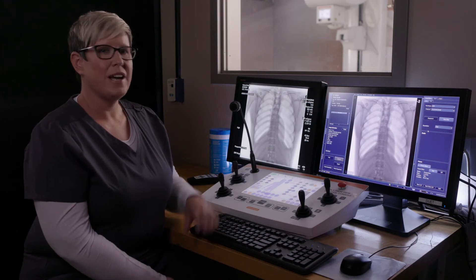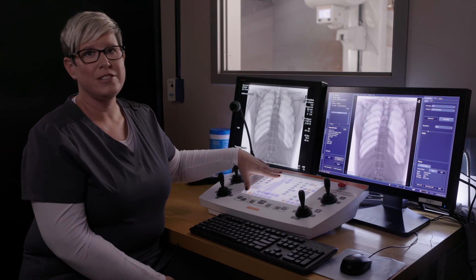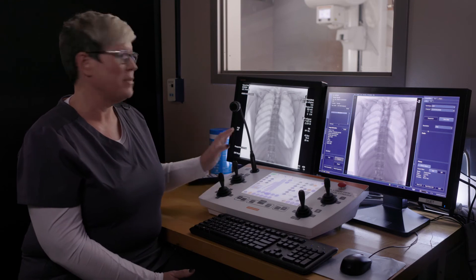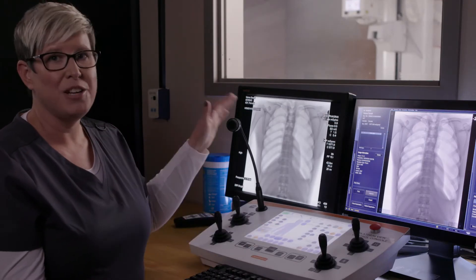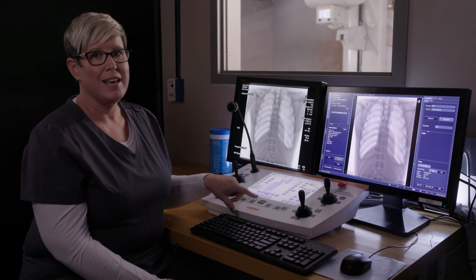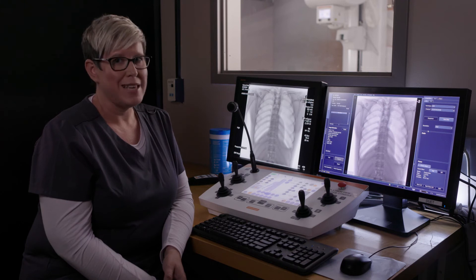The easy to use console features a large 30 and a half centimeter color touch screen and intuitive controls. It integrates all table movements, generator settings, and collimator controls. It is equipped with both a camera and a microphone and provides access to live video with full screen viewing. With a simple press of the move button, the table will automatically position itself based on examination settings, increasing the speed of the exam.